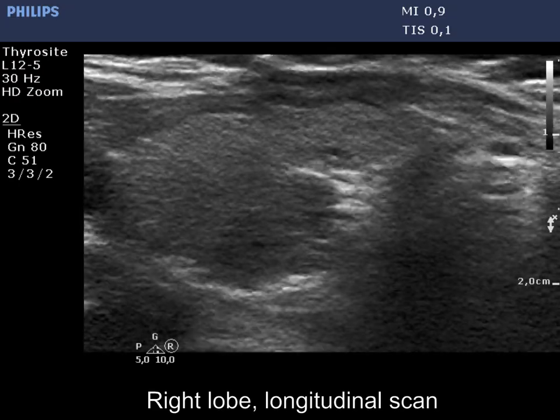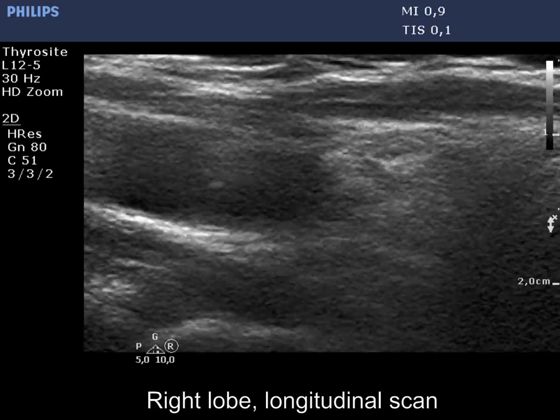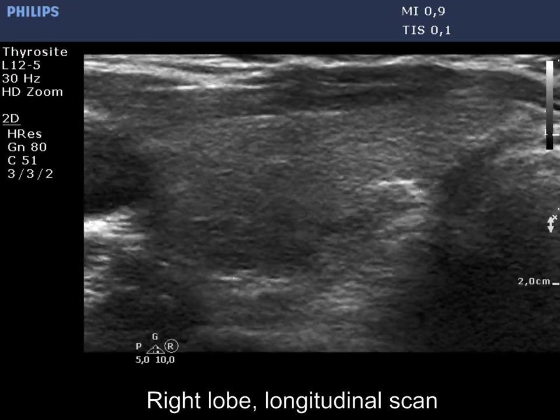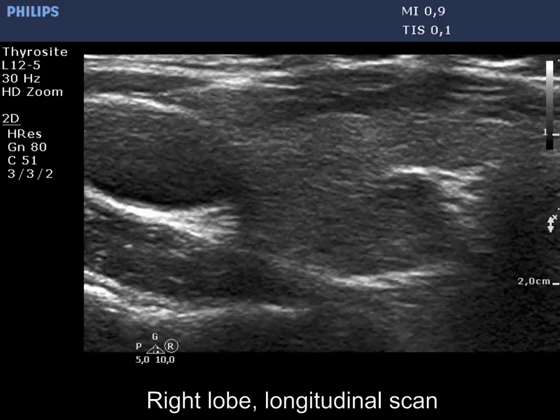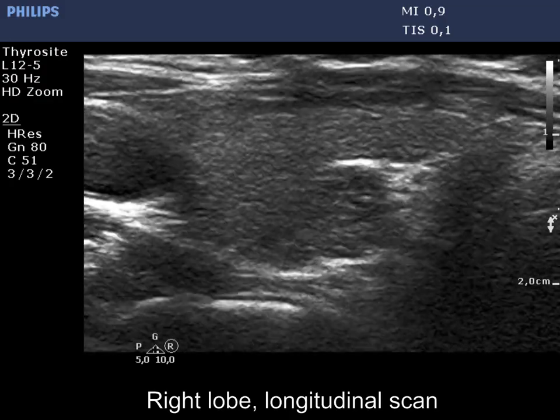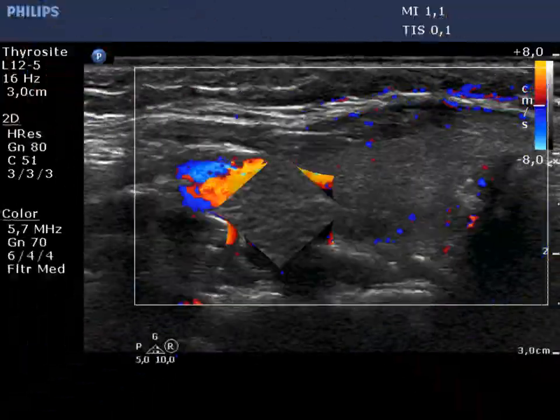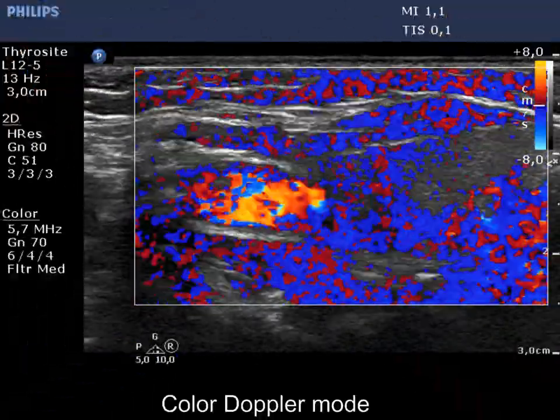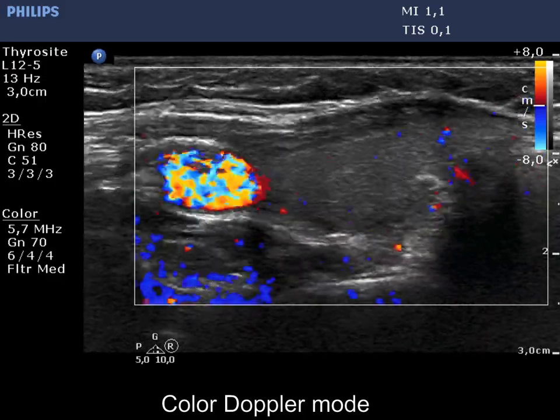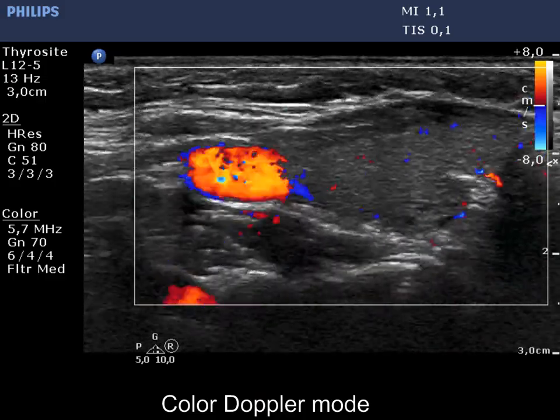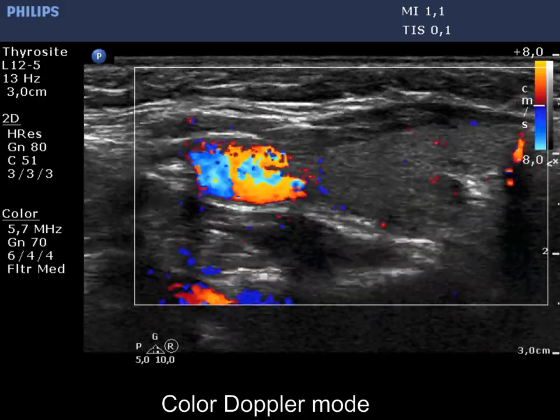If we had any doubt, the longitudinal exam must solve this. There is no difference in the vascularity between the different parts of the lobe.